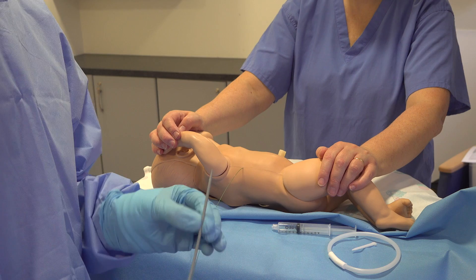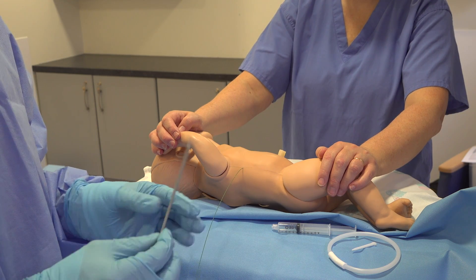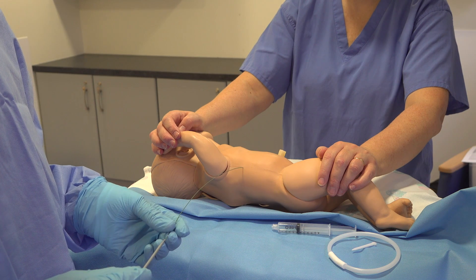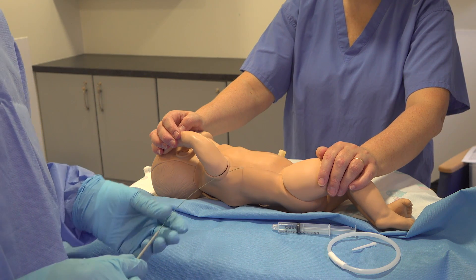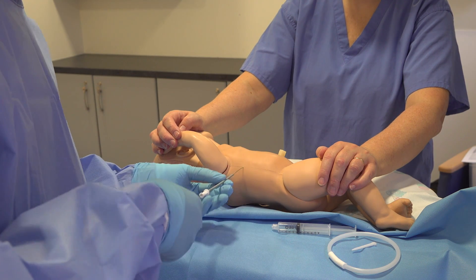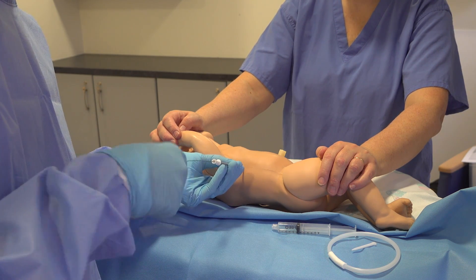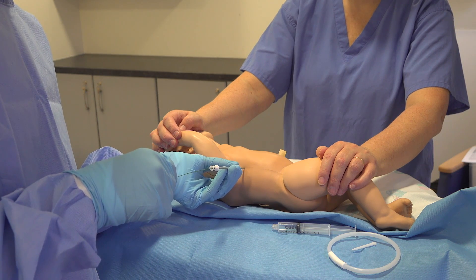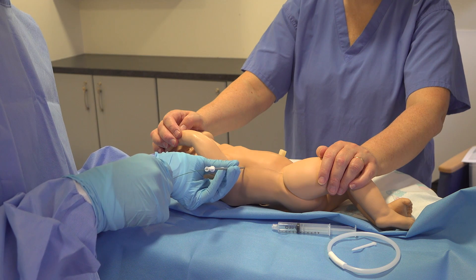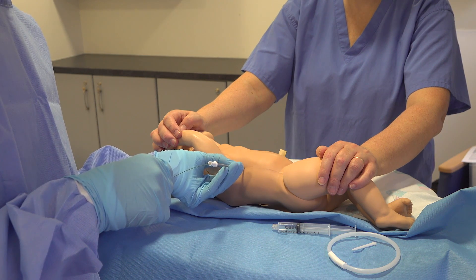Take your dilator — that's going to just create a bigger hole in the skin to make it easier to get your drain through. Place the dilator over the top and dilate the skin. Wait about 10 seconds and just gently roll that in your hands.